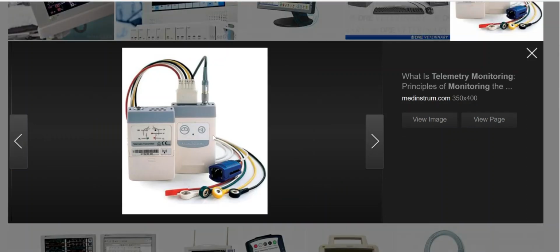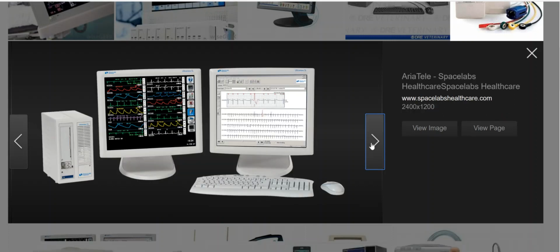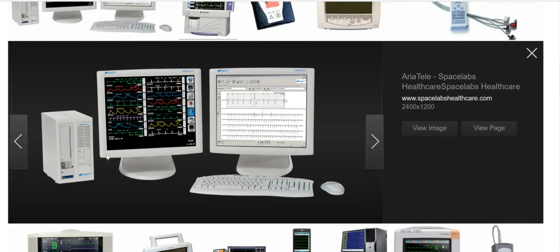Telemetry orders can include pulse oximetry with telemetry or without. So many times you'll see that there is a sensor for pulse oximetry. A monitor would be in a centralized location and would alarm if they exceed a certain rate or some dysrhythmia or irregular beat arises.